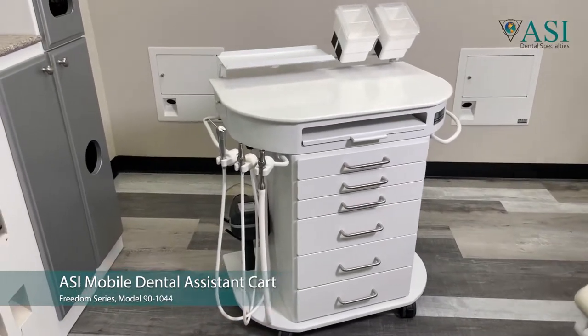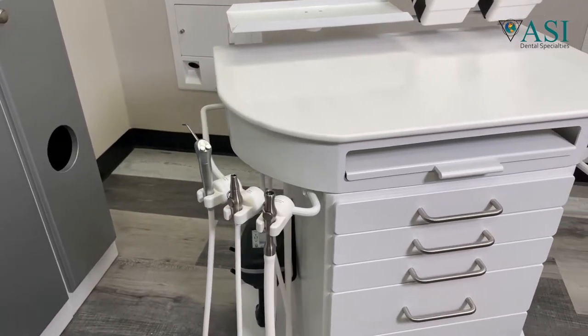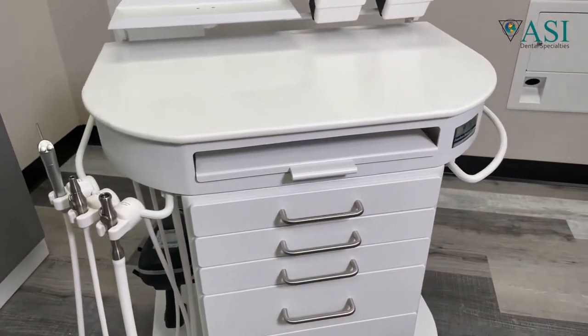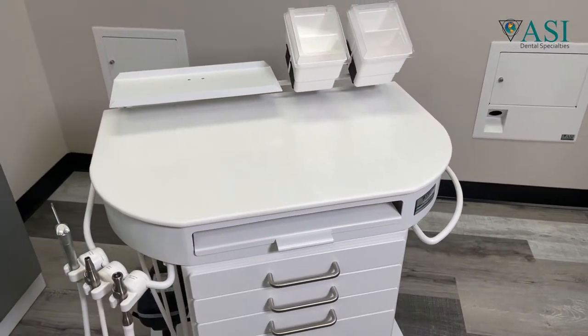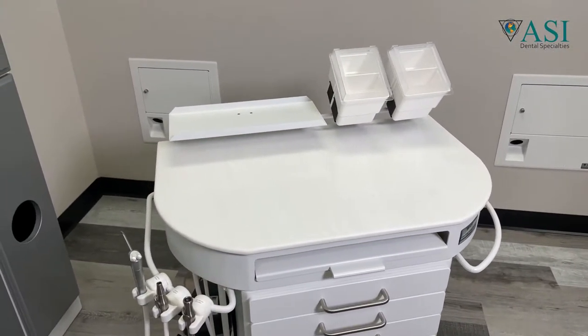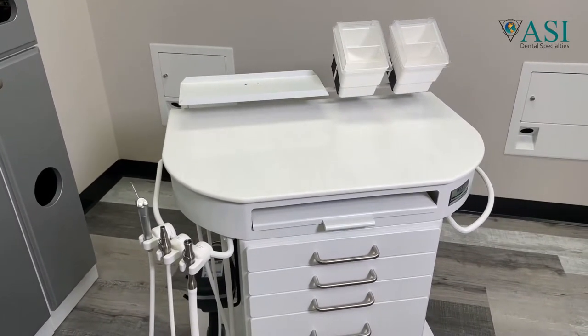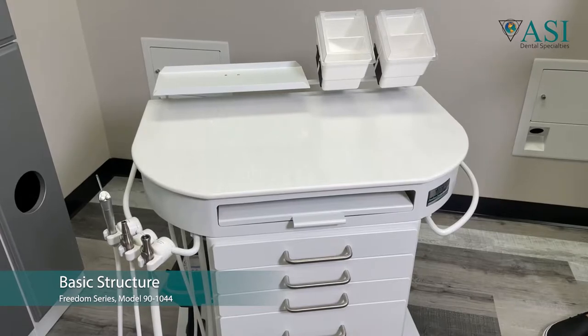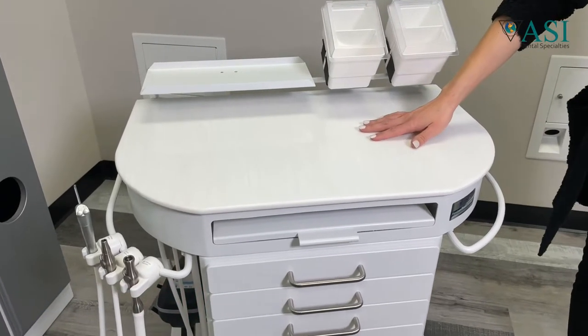This is ASI's Freedom Series mobile dental assistant cart, model 90-1044. The Freedom Series features unparalleled mobility for the assistant and the doctor. The rounded corners make it ideal to get up close to a patient's chair while eliminating obstructions within the room. The basic structure overview of this system includes a marbleized Wilson artwork top that's non-porous.